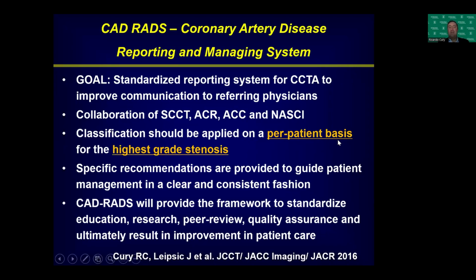CAD-RADS really became the framework to standardize coronary CTA reporting, providing a tool for education, research, peer review, quality assurance, even data mapping. It's very easy to go back over the past 5 years and map all the CAD-RADS 3 patients and see what happened with them, if they had functional imaging, if they had cardiac cath. It's really easy for data mining and even AI tools.